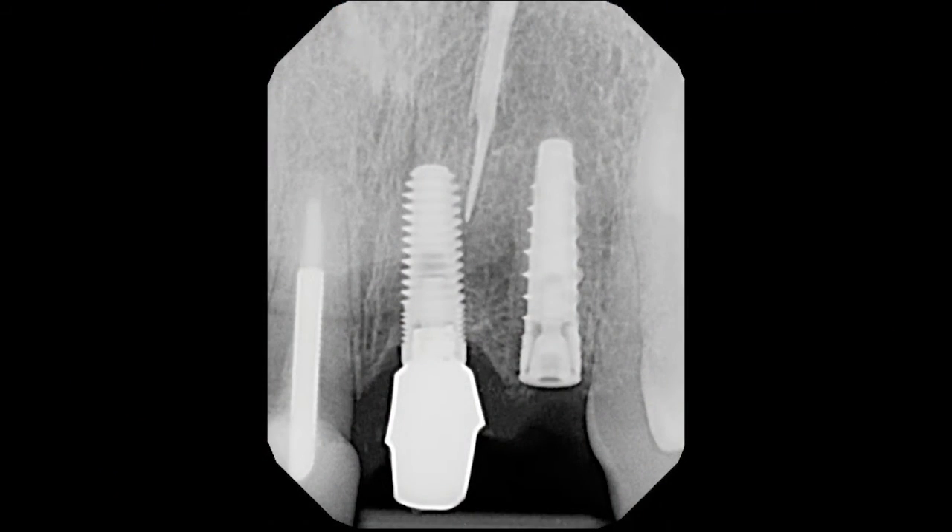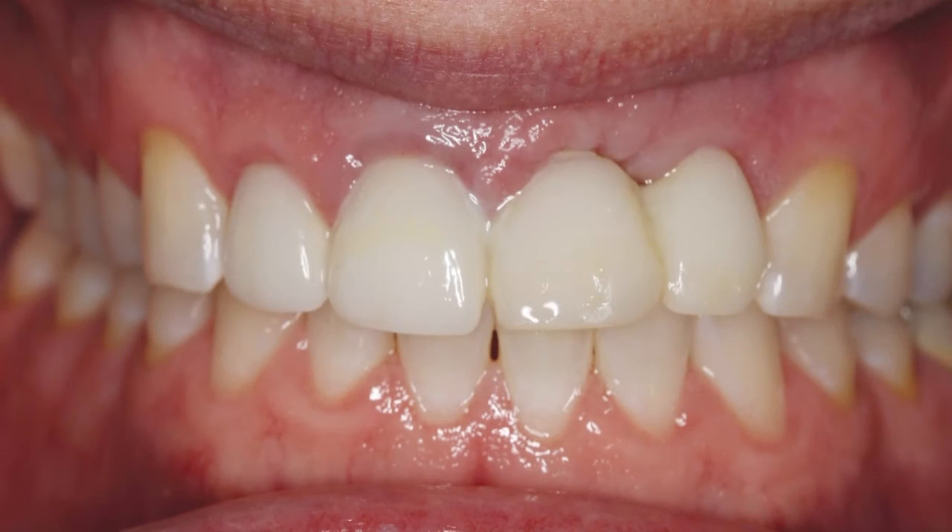Radiography confirmed that the implant was placed in an optimal position. A transitional bridge was fabricated to minimize speech problems, help support the soft tissue, and maintain natural emergence profiles in the areas of tooth number 9 and 10 during the healing period. The implant site was allowed to heal for approximately 4 months.